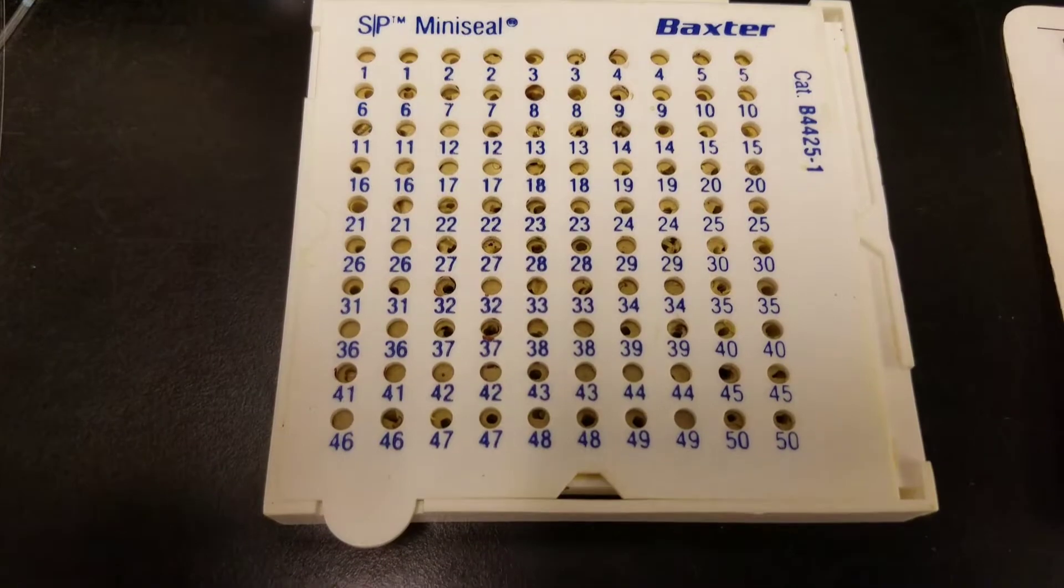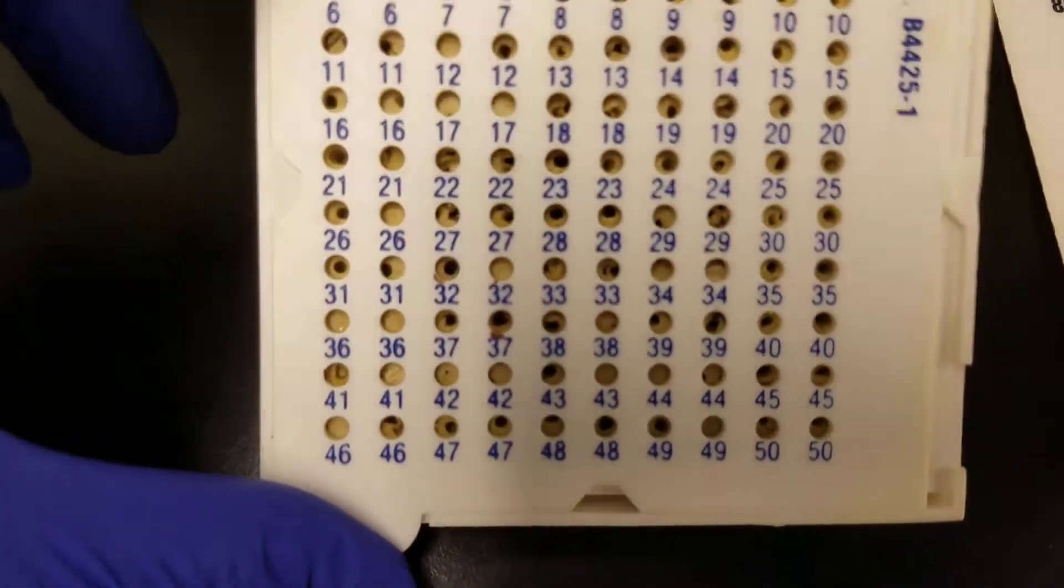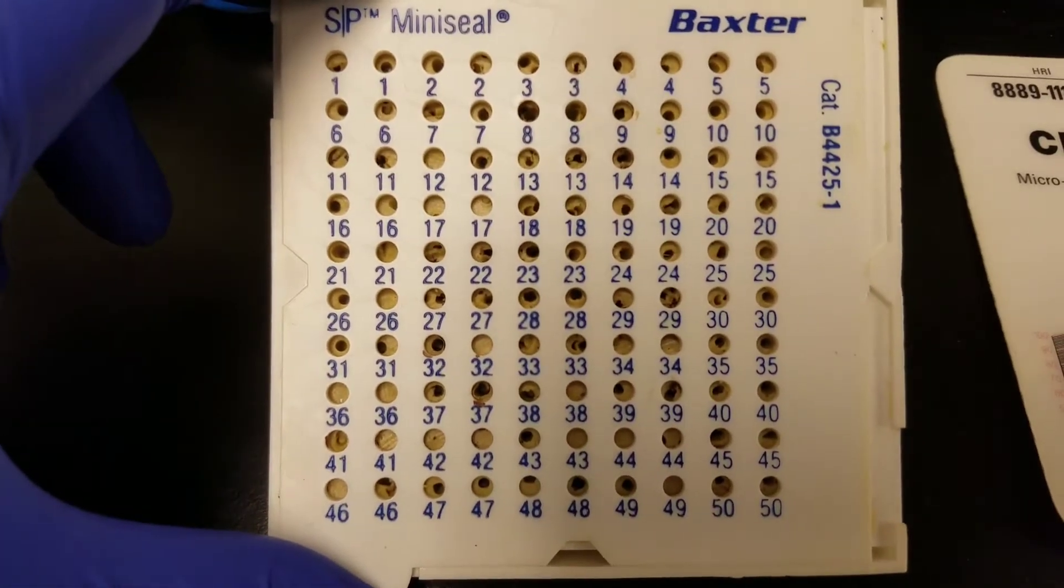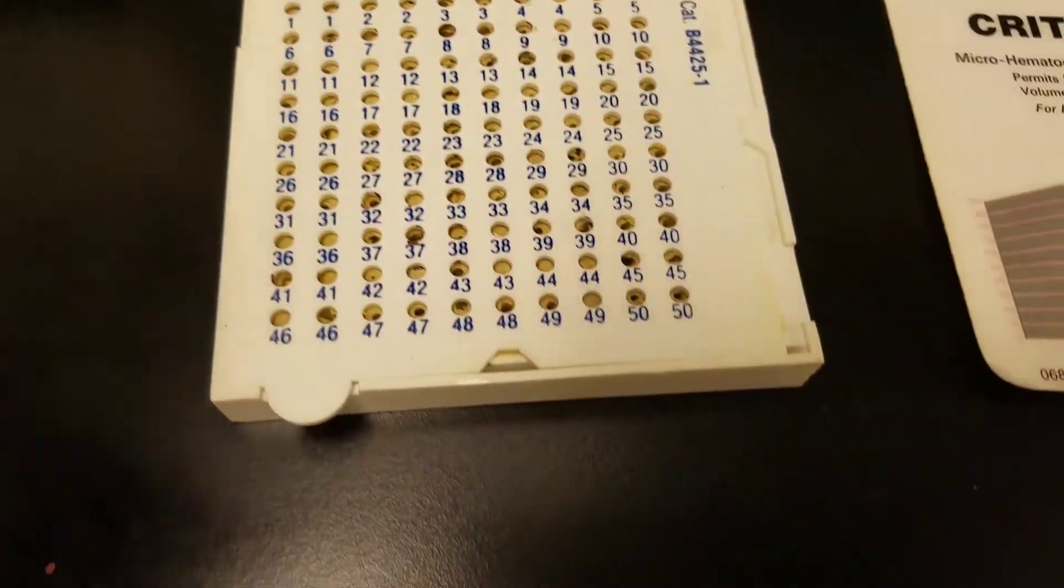Besides the tubing, you will also need something to seal it with. This little tray is called a Baxter Mini Seal. Kind of old looking. But you can see all the holes that have already been used up with the clay-like substance.